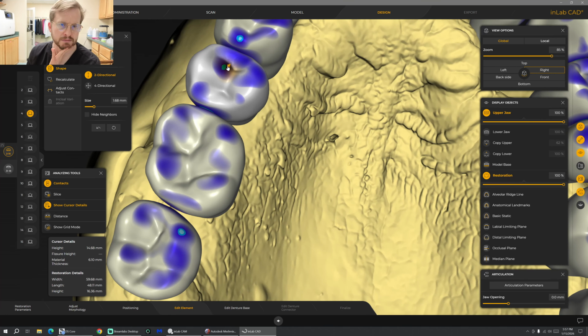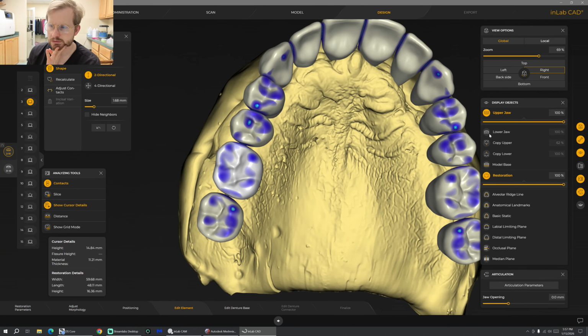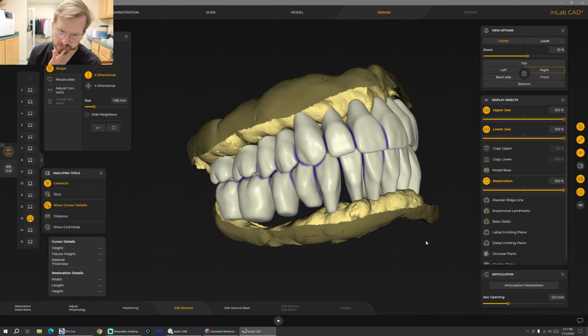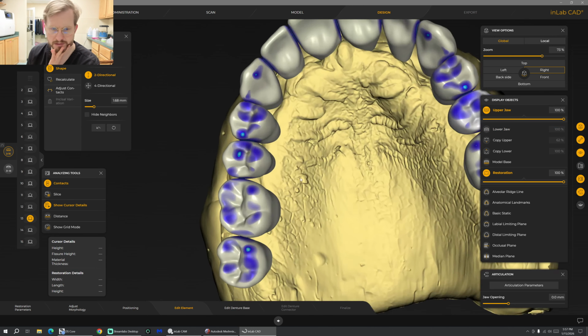So again, let's see, where is his? All right, let's try and put most of those contacts on the lingual cusps here.